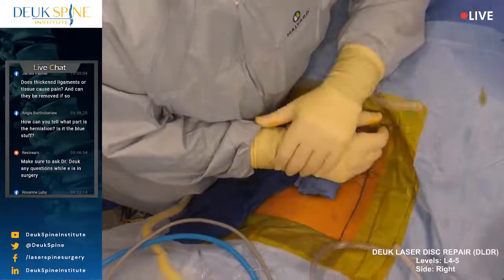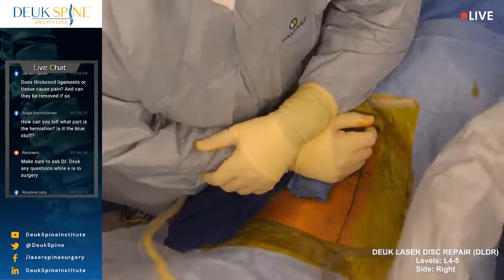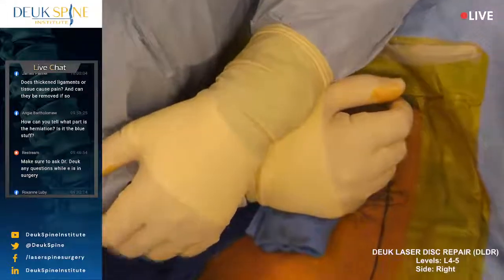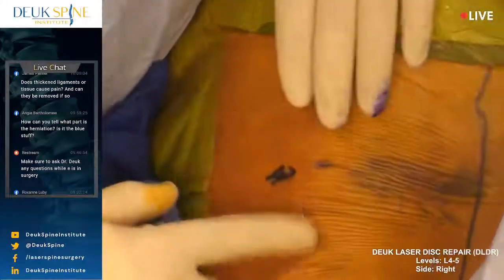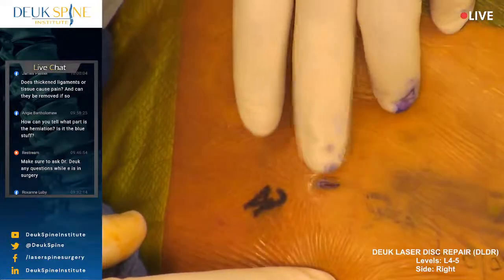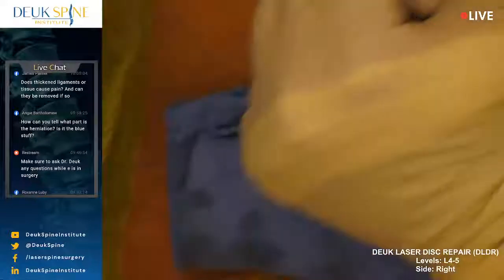I would grab the camera and the light cable. All right, I'm going to show you all the incision that we use to do the surgery. I'm just holding a little bit of pressure for now. Lay still. Unfortunately, some people are a little more combative than others. Can you see this, Diego? Yes, we saw it. Right there. That's a tiny little cut. All right, pressure and stitch it up.